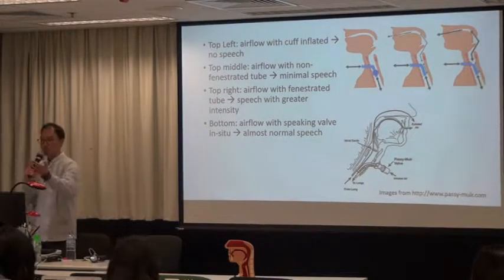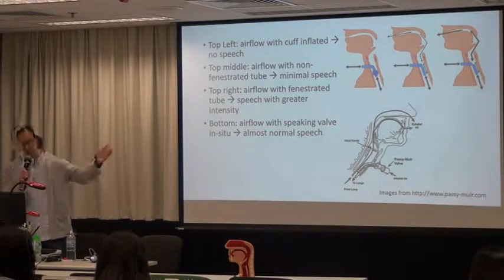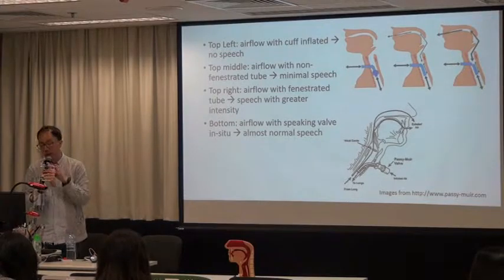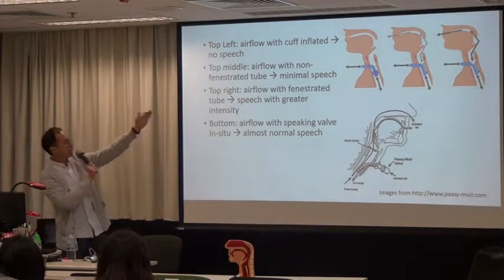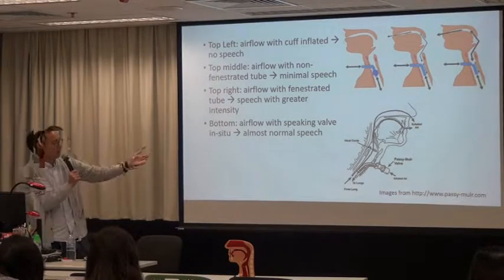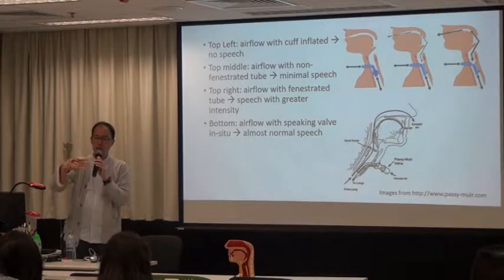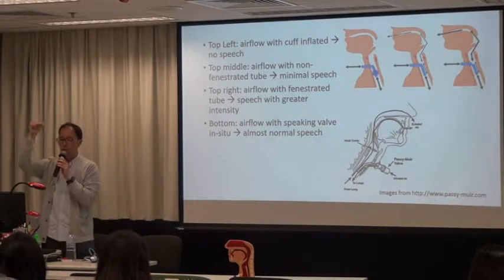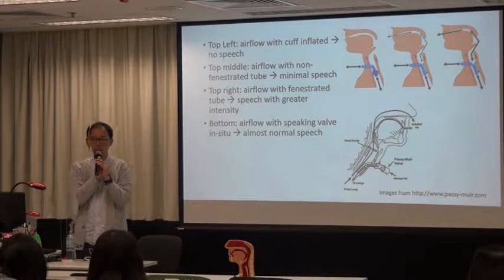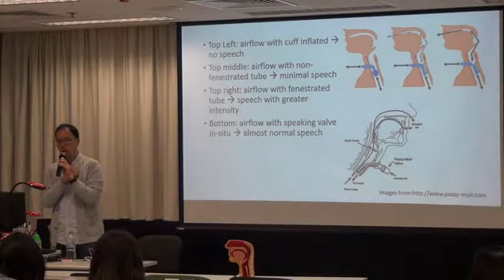Okay, but the better thing is that don't make your first mistake, right? Okay, so never occlude someone with a cuff, and especially when you see the cuff is inflated. Okay, so that's how we talk under different conditions. But if you ask the patient, whenever you want to talk, use your thumb, push against the tube, okay, or occlude the tube. Is it a good thing?